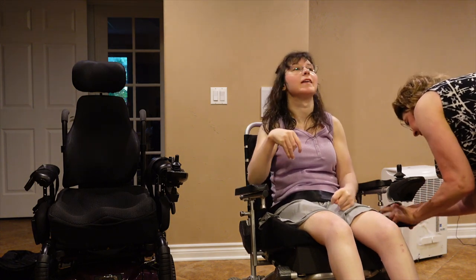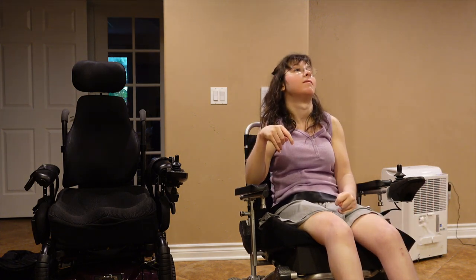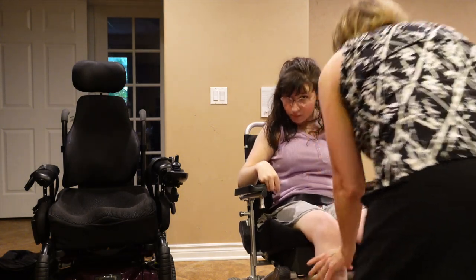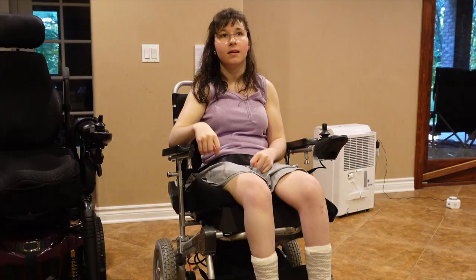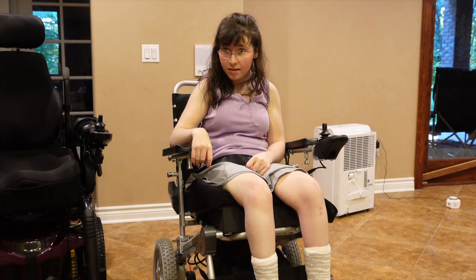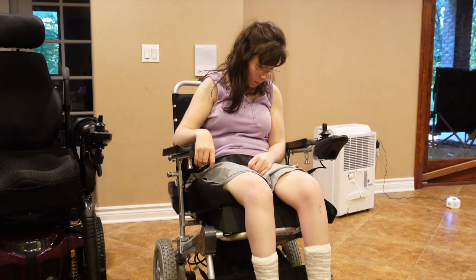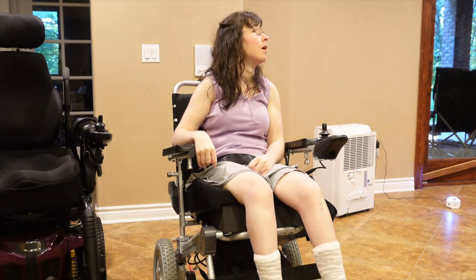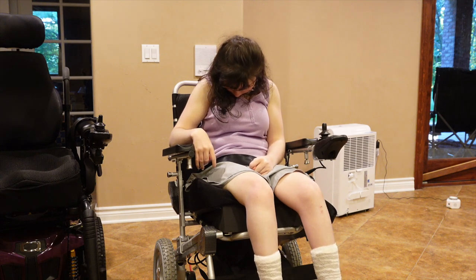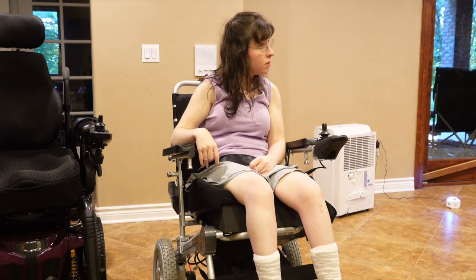It's like sitting in my chair — you like that wheelchair? That works good. And that's what our problem is. So that is fancy seating. I'm thinking — that's good, I like that. But we have to raise the footrest about three inches, and I think that'll solve our problems.